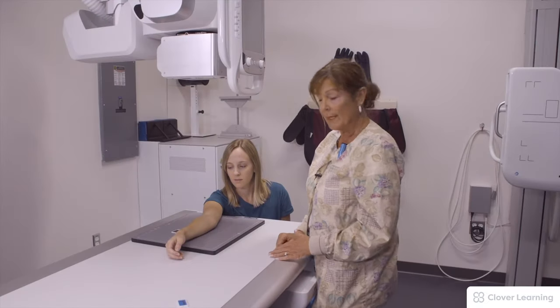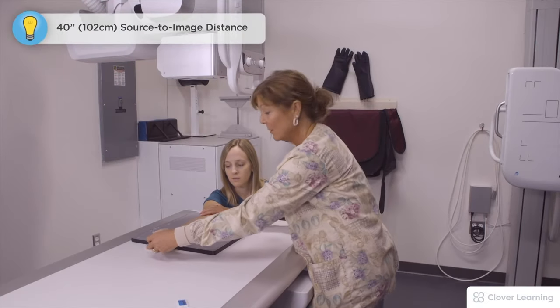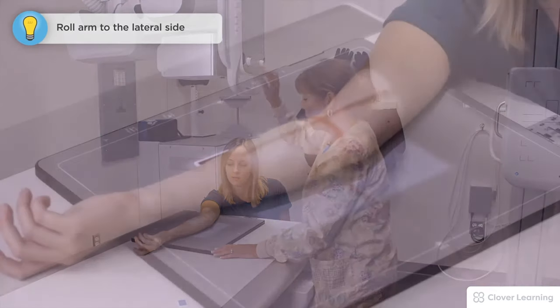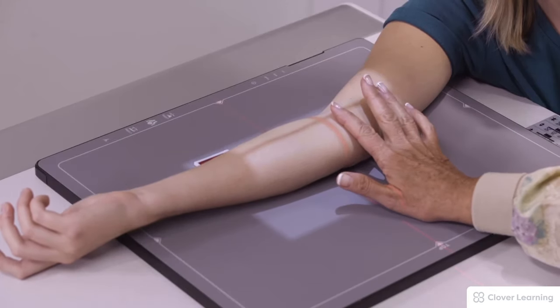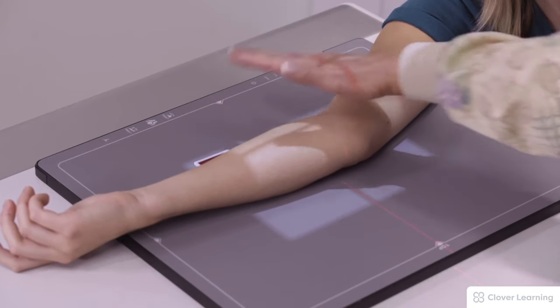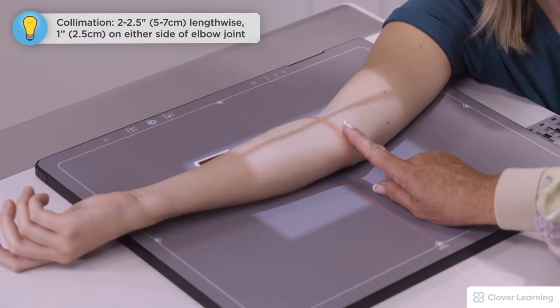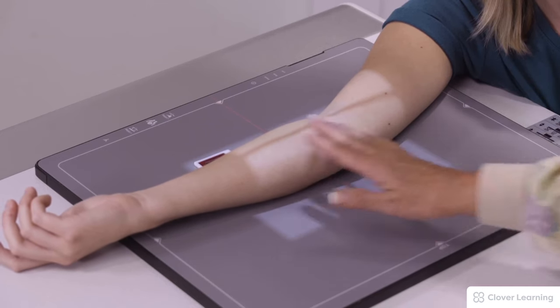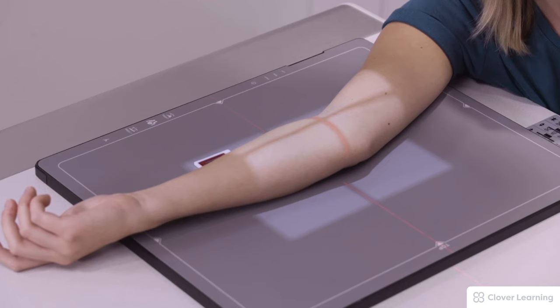The lateral oblique, we're going to have the patient roll to the lateral side. It is an awkward position to hold. We're going to still center at the elbow joint. We're rolling away from the midline, so we're rolling to the lateral side. We're going to see the radial head and the radial neck, and we'll definitely see the distal humerus and the proximal radius and ulna. The patient holds very still.